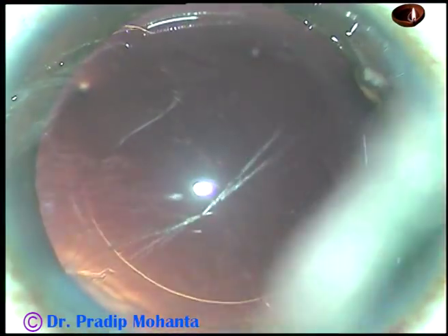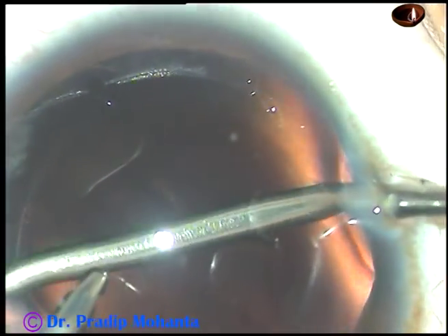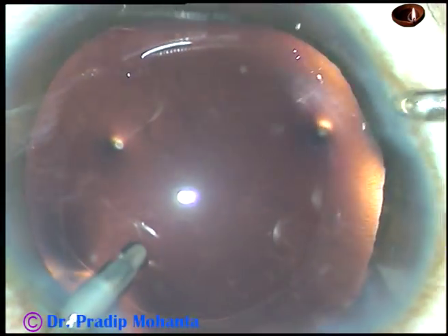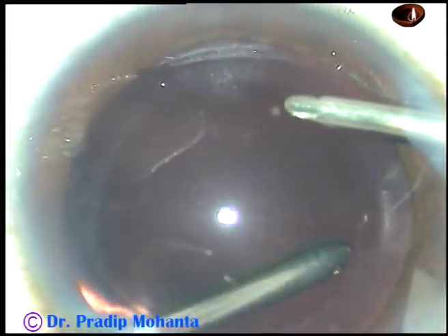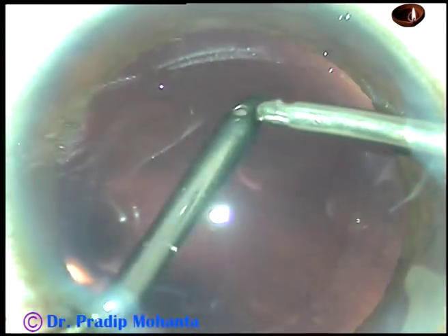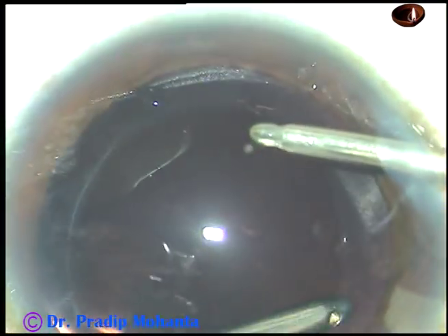Now, this is hydropolish. There is a very small amount of cortex at around 2 o'clock and it is being removed. The under surface of the anterior capsular rim is polished. I am in IA2 mode where the vacuum is very less, so you can hold the posterior capsule and polish the posterior capsule. The posterior capsule is now nicely polished.